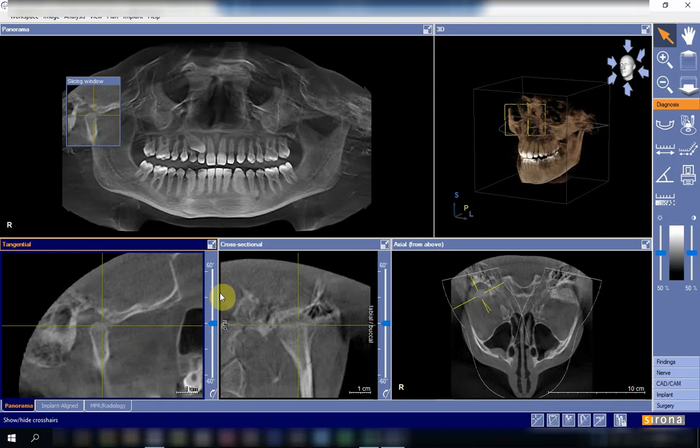Both of these will give us a 3D representation of the soft tissues. One is not invasive. The MRI has no radiation, while the other one is invasive, in which there is a great dose of radiation if it is compared to the cone beam CT.